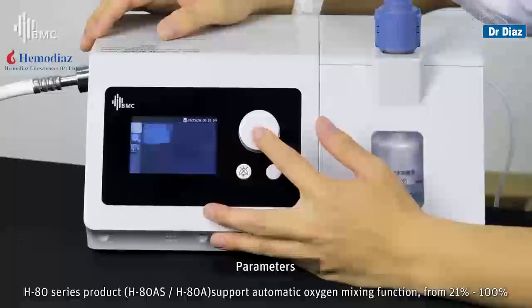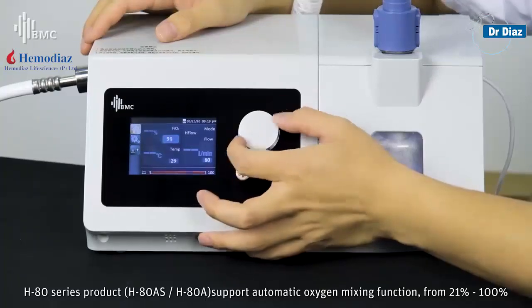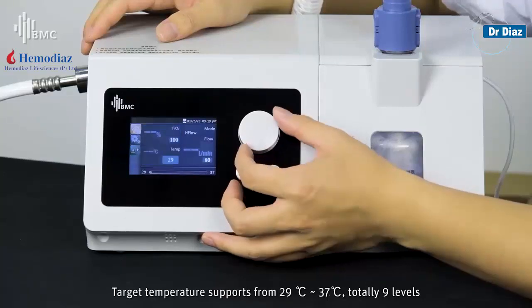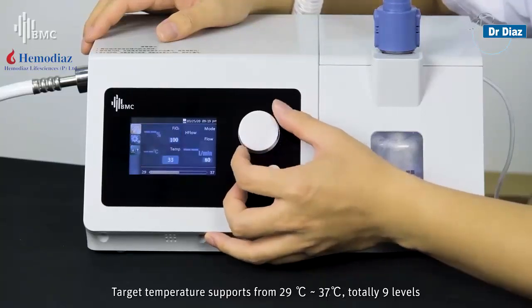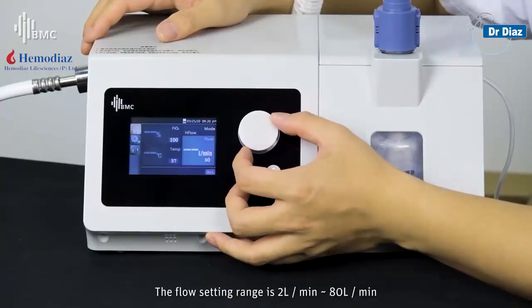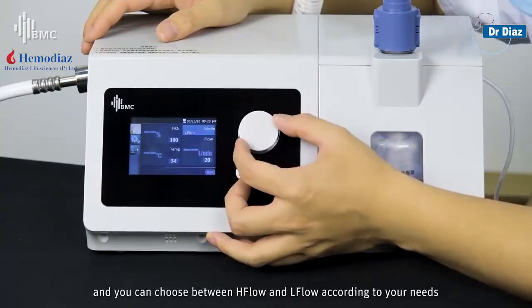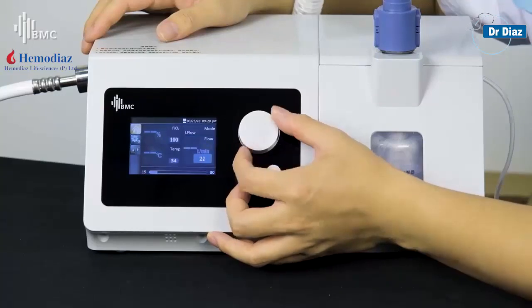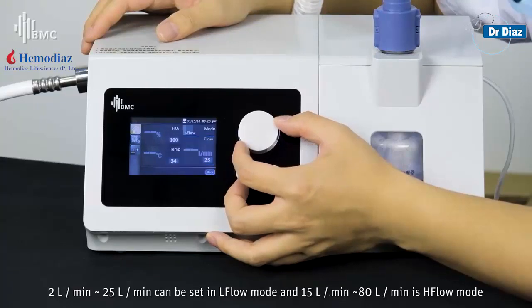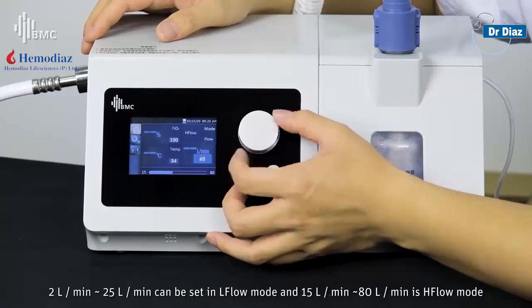Each H80 series product supports automatic oxygen mixing from 21% to 100%. The flow setting range is 2L per minute to 80L per minute, and you can choose between high flow and low flow according to your needs. 2L to 25L per minute can be set in low flow mode, and 15L to 80L per minute is high flow mode.